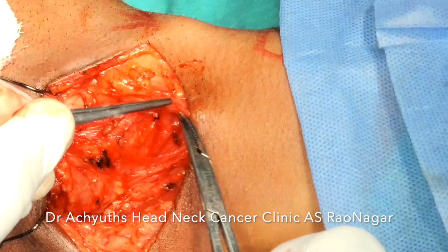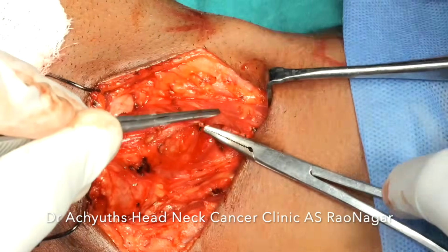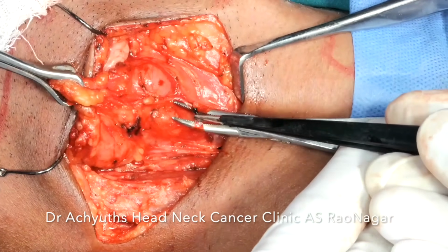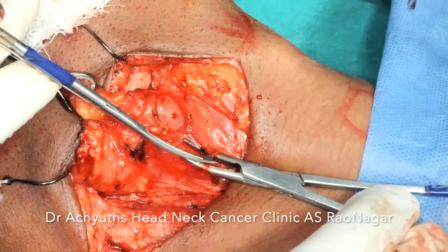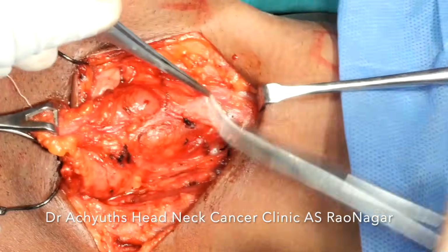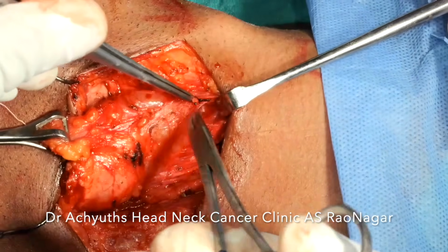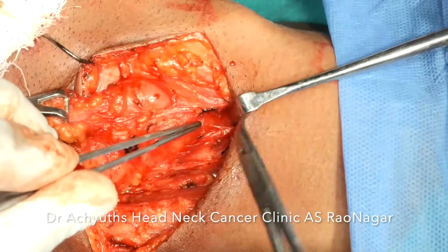This is only possible when we are doing layer by layer dissection, or else it is very easy for us to damage these neural structures, if not physically, functionally, by giving thermal damage to them. So only when we are confident that we are very much away from the neural structures, I am using monopolar cautery. Otherwise I will be using a bipolar cautery, and sometimes with a saline squirt onto the bipolar cautery when we are working, so that the thermal damage is minimized.